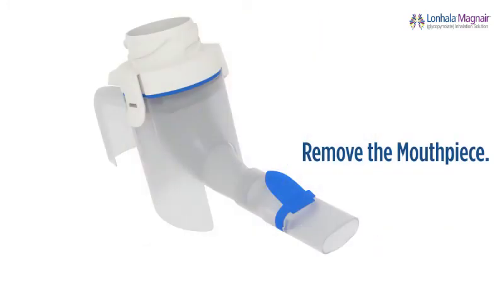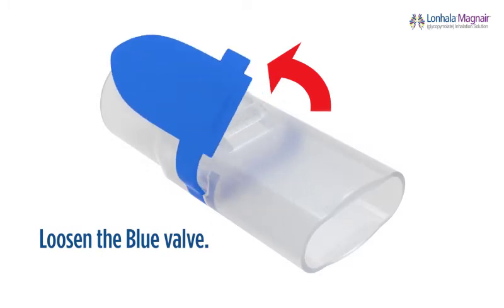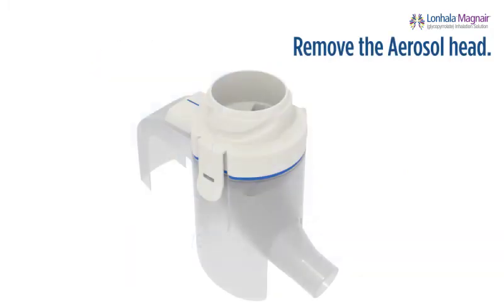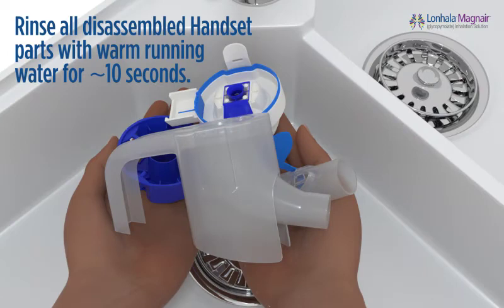Remove the mouthpiece from the handset body by giving it a gentle twist and pull to separate it from the handset body. Carefully loosen the blue valve from the slot in the mouthpiece, making sure the valve is still attached on one side. Open the handset body by lifting the clasp on the side. Then remove the aerosol head by lifting the handle. Do not touch the center of the aerosol head. Set aside the aerosol head to be cleaned separately. Do not wash the connection cord, controller, and AC adapter.